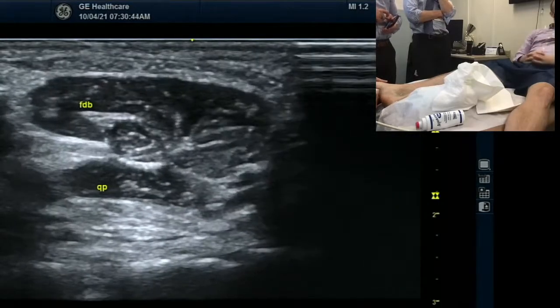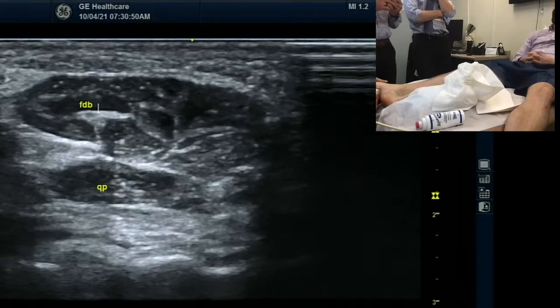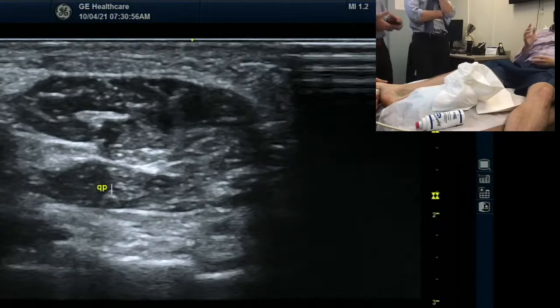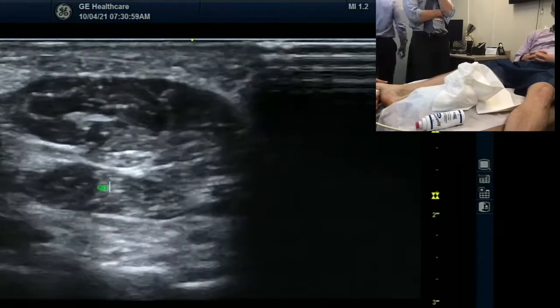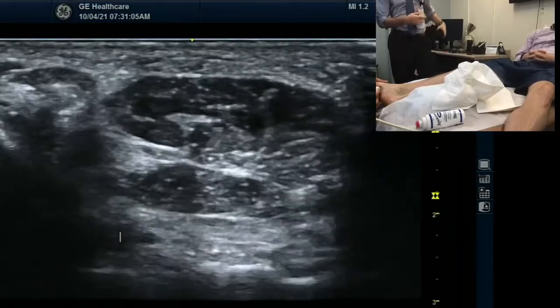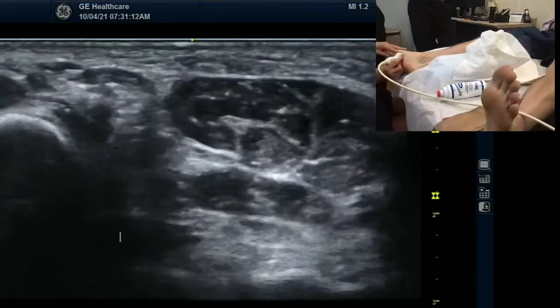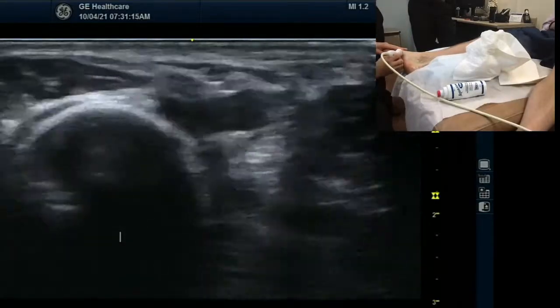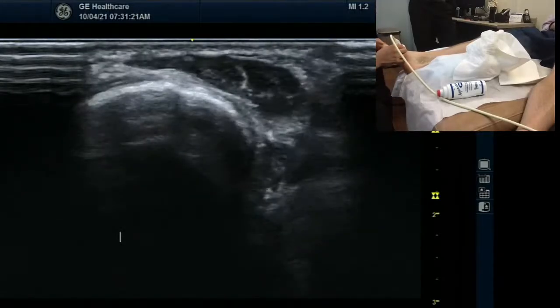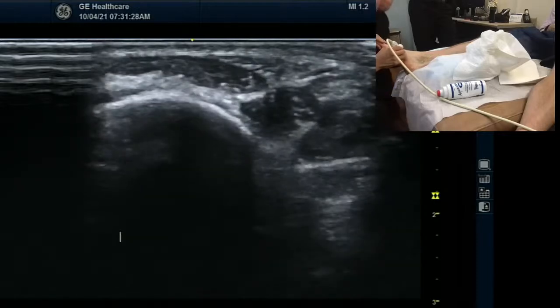So let's get rid of those FDB and QP. Unless you want to freeze that one right there — that's beautiful. And what's the role of QP? Quadratus plantae. So I'm going to go this way. It's coming around really nicely. That was a good picture. I'm trying to see if the picture is coming — your foot is coming. Foot model. You need to get the credits from this one. So I think this is abductor hallucis. Since I'm on the... I'm abducting his greater toe. Have him isometrically contract.